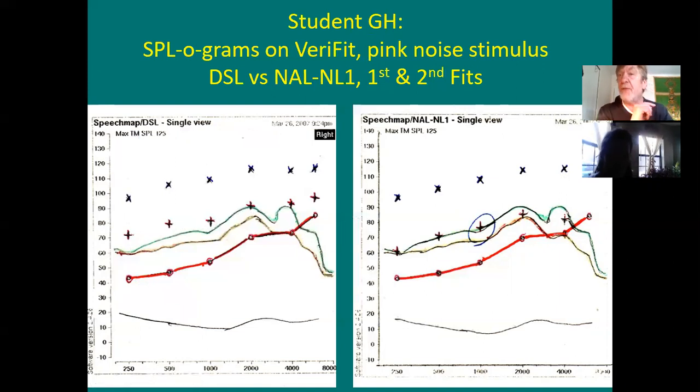Now, we programmed the hearing aid on the manufacturer fitting software according to DSL-4. We chose DSL-4, and the software said, yep, you're right on target, looks good. We moved the hearing aid over to Real Ear, entered the audiogram on the Real Ear system, chose DSL-4, and said, okay, hearing aid, deliver. Let's see what you're getting. And in actuality, what we were getting was the brown. Look at how far below target we were. We had to reprogram the hearing aid to make it more closely match target.